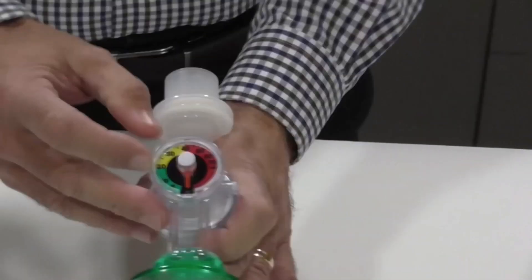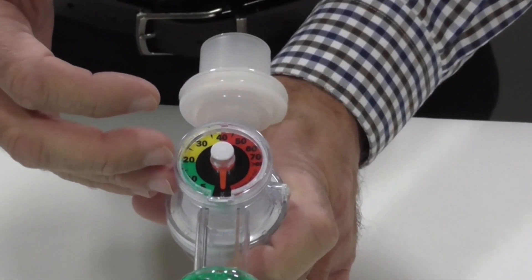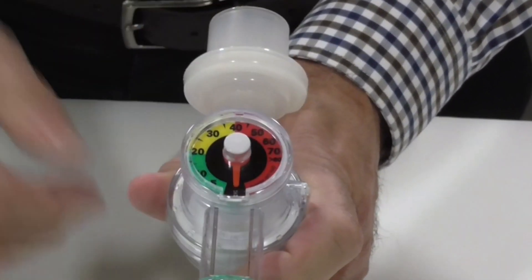You can see the manometer is color-coded. It's green from 0 to 20, yellow from 20 to 40, and red from 40 and above.